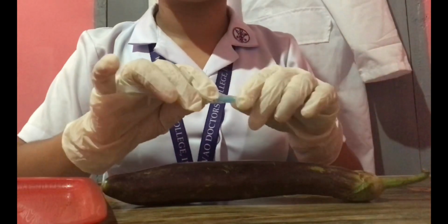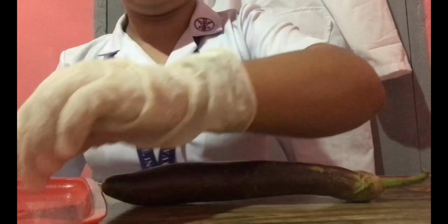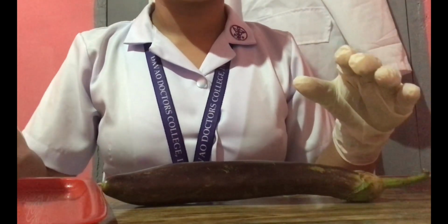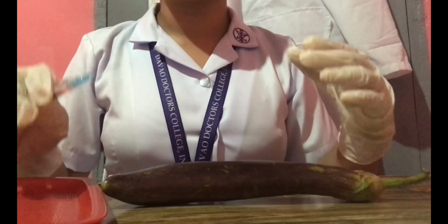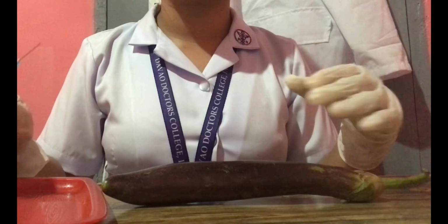And remove the needle cover and discard it without contaminating the needle. If using a pre-filled unit dose medication, take caution to avoid dripping medication on the needle prior to injection. If this does occur, wipe the medication off the needle with a sterile gauze.